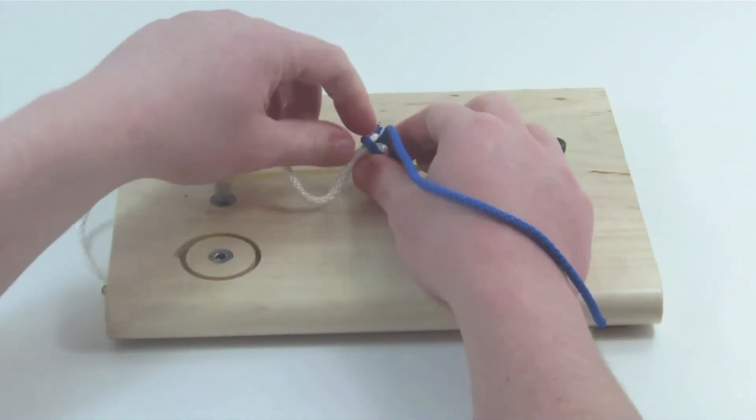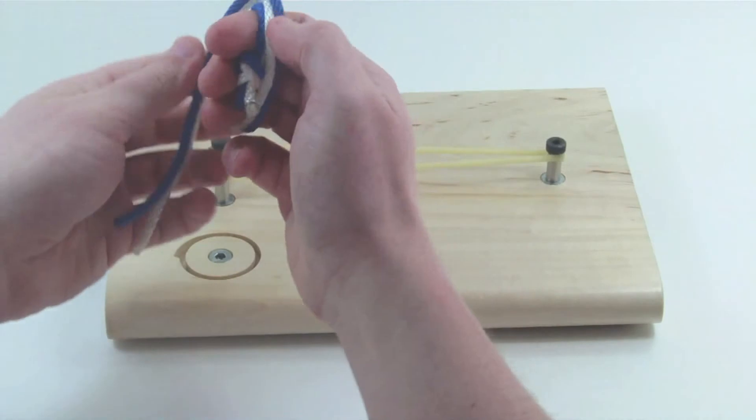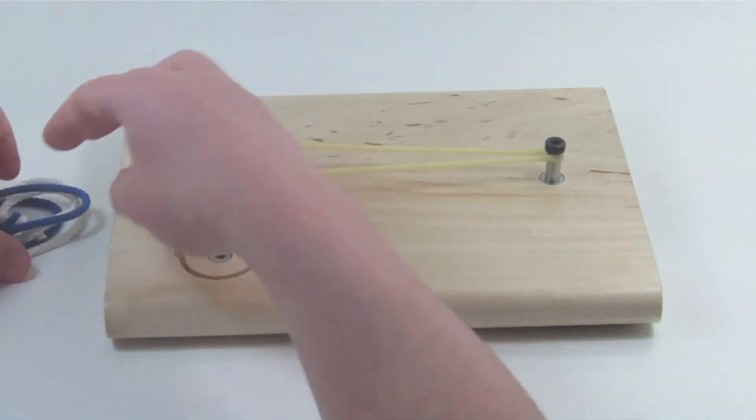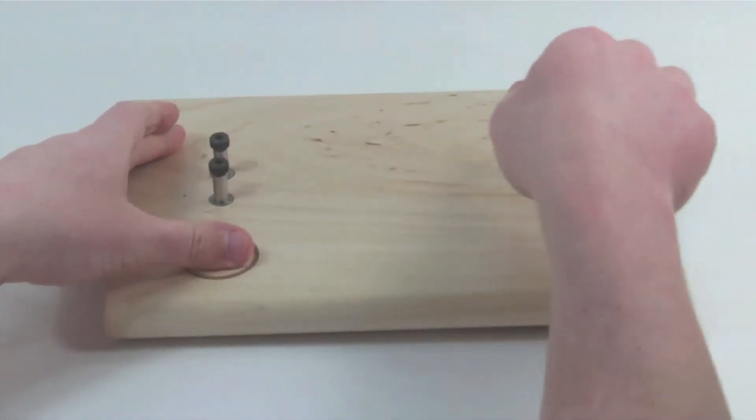When you are done practicing hand ties, the components can be easily disassembled and placed back inside of the kit.